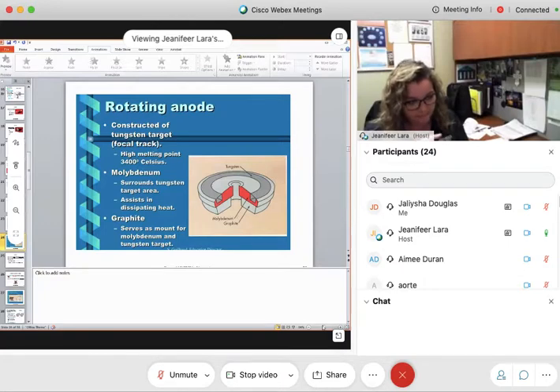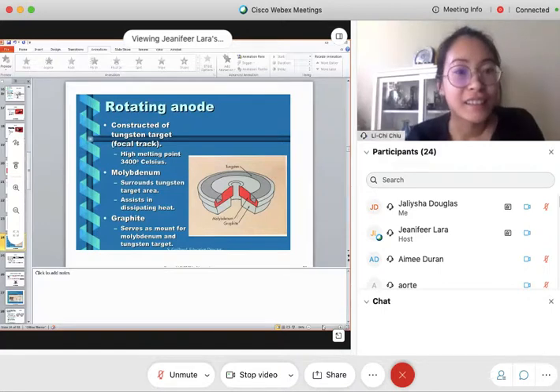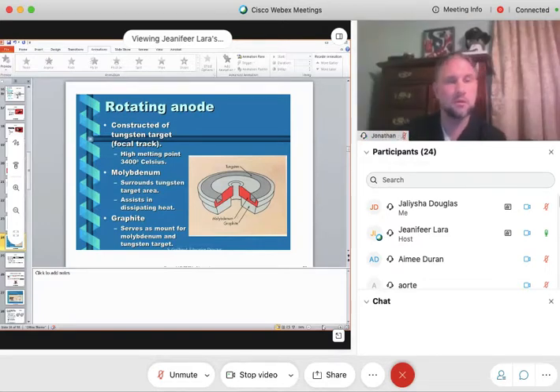what, Sharon? Tungsten with? Okay, Jonan, what is tungsten mixed with at the focal track? Rhenium.